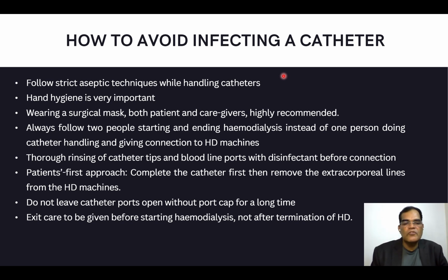So we need to follow the cleaning procedure of the tip of the catheter as well as the bloodline with a top to down wiping method. That will help in preventing touch contamination.